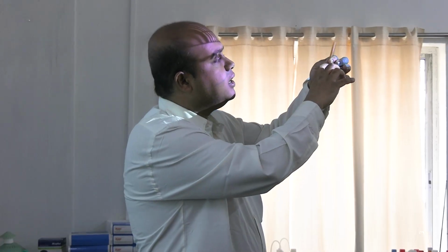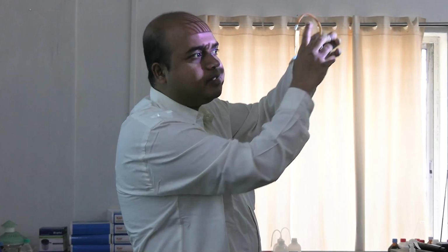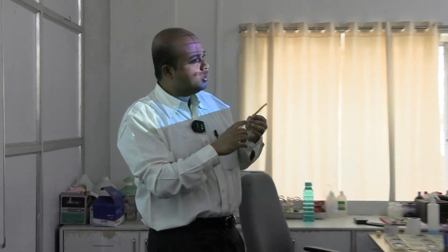Above this bulb, this is called the bulb of the pipette, there is a marking called 11. So the 11 marking means it is 22 times the volume of 0.5. If 0.5 is, as an arbitrary figure, 4 microliter, then up to 11 it is 4 into 22. That is just an arbitrary figure. So these are not 0.5 microliter, remember that. This is just parts of volume. We don't consider any particular unit of volume while taking the blood. We take blood up to 0.5, this is just for how many times the blood is diluted.